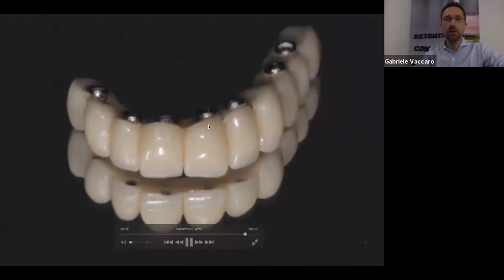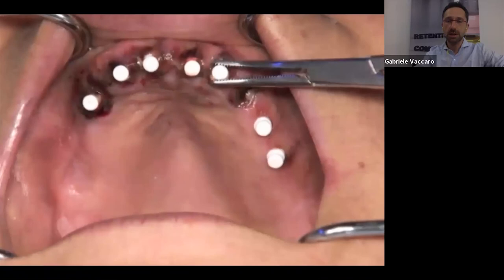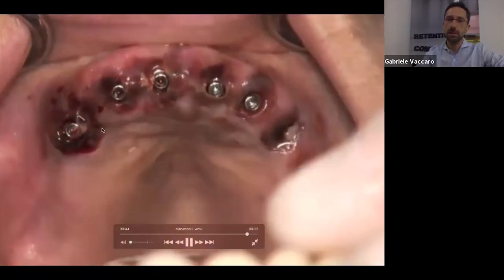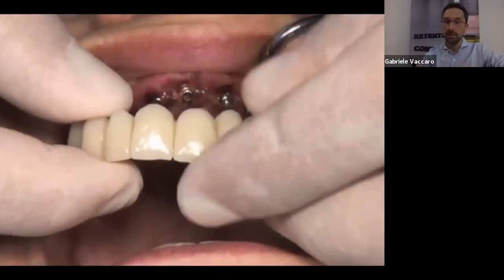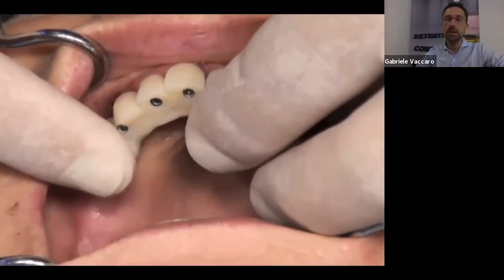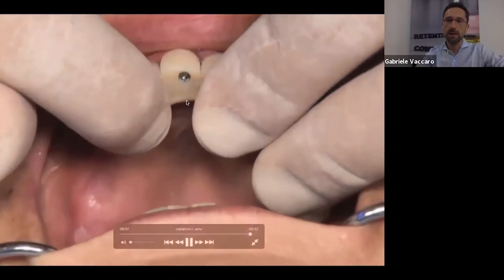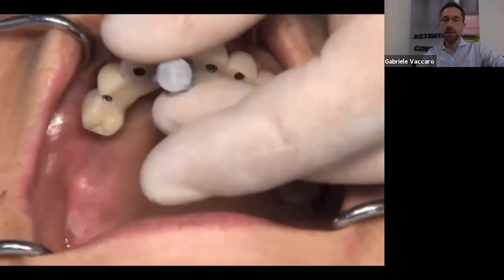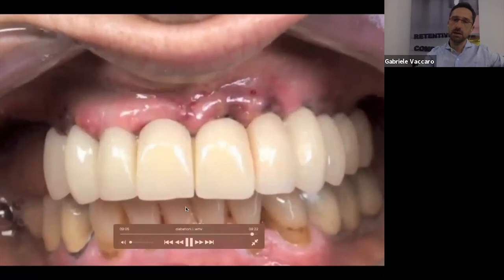And in the afternoon, after 3 or 4 hours, in the morning we did the surgery, and in the afternoon the patient waited in the office. This is the real time, no shortcut. This is the real time when we deliver the temporary bridge to the patient. Clip and clip. This is the prosthetic step of the immediate load on the day of surgery.